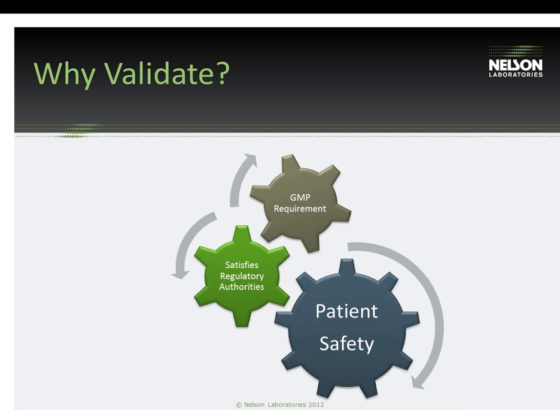There are also other benefits to performing a cleaning validation, one being to satisfy regulatory authorities. These validations are really a hot topic in the industry right now, and we've seen increased awareness from regulatory authorities such as the FDA, where they're starting to ask more manufacturers for this validation data, and they want to see it on file.